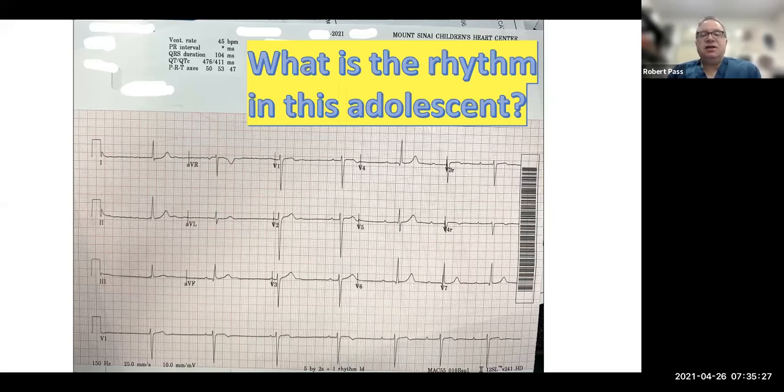I should also mention that a Holter was done before we saw this patient, although I put my own 7-day Zio on this patient, and it showed that she can go to 165 beats per minute, 1-to-1 with a long PR interval. So I don't actually know what this patient has. I don't understand why they're this bradycardic. This falls into the bag of idiopathic, but I think that this is certainly something we would be concerned about, and I would generally recommend monitoring somebody like this.